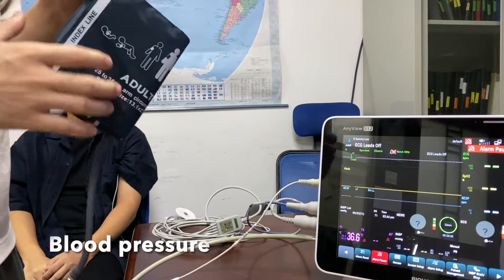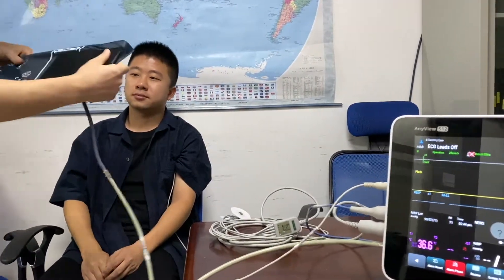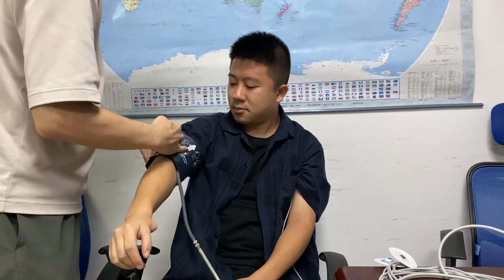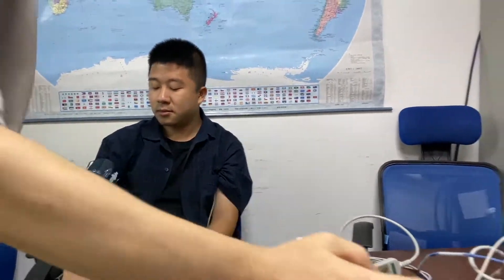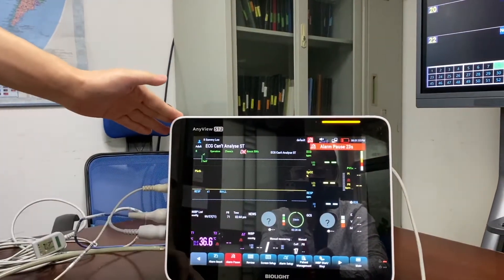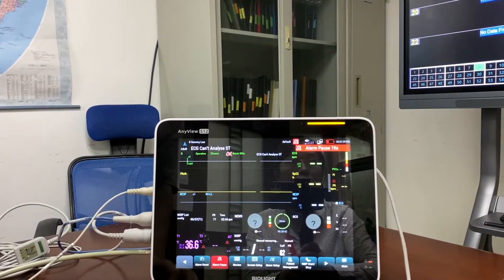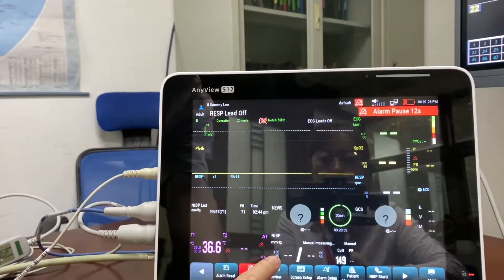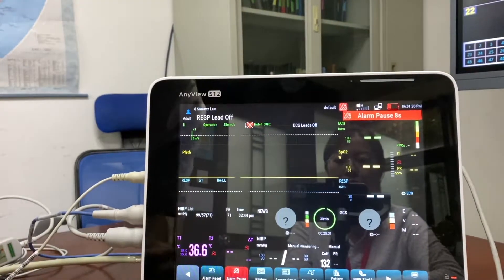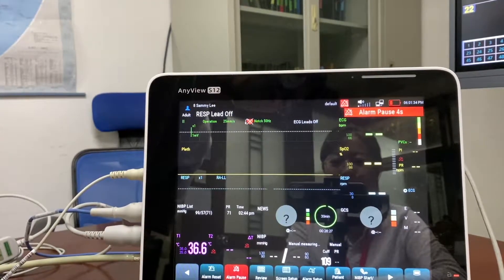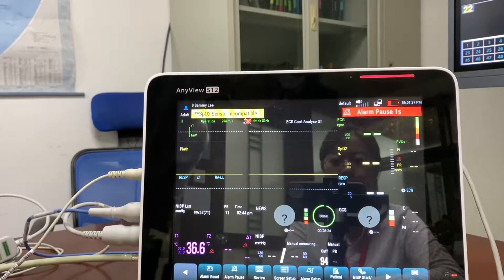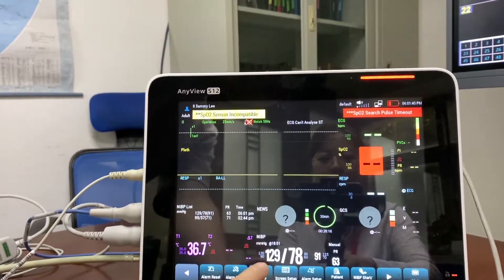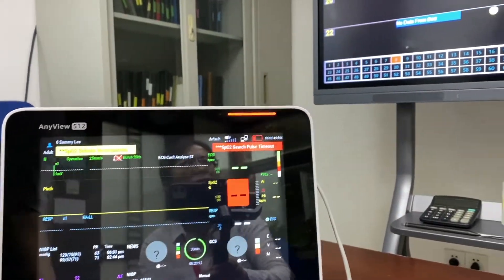Now I'm going to show you how to check blood pressure. We have a blood pressure cuff and we'll put it onto the patient's arm. We wait for the reading, and the blood pressure reading will be reflected here for NIBP. His blood pressure is 129 over 78. In the CMS you will also be able to see the readings in real time on the other display.